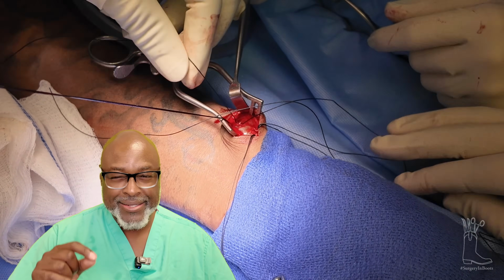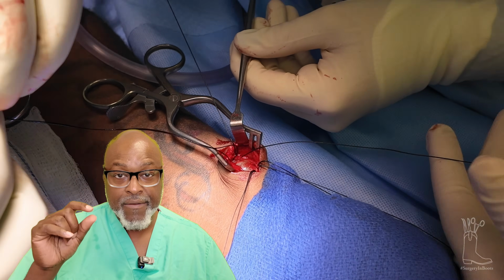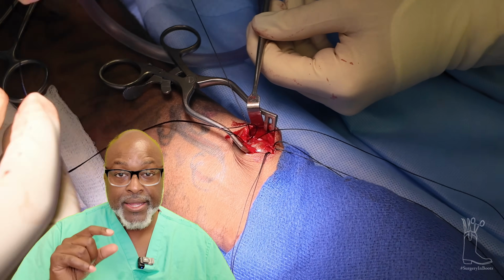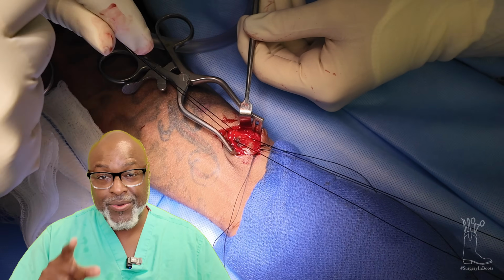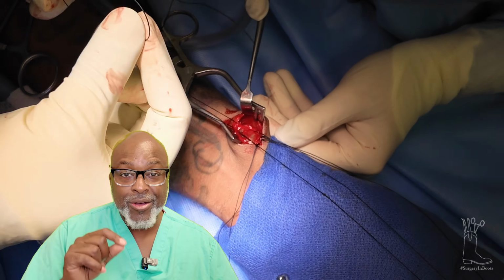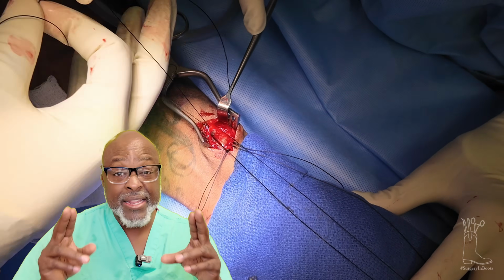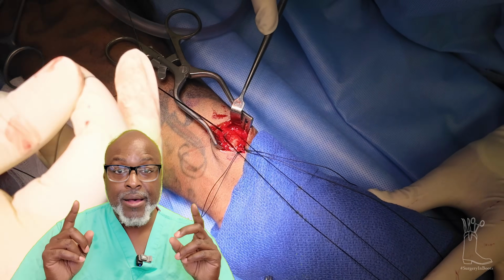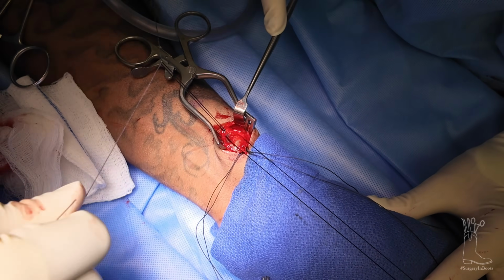So some of this you can't see in the video, some of it you can. Essentially, there's a vein that ruptured into a ganglion cyst. Either the ganglion cyst was there first and then the vein ruptured into it, or the reverse, or there was trauma that caused an aneurysm. So either way, we had to ligate the vein on both sides, and then make sure right before you ligate a vein, you got to make sure that patient has a pulse. He does.